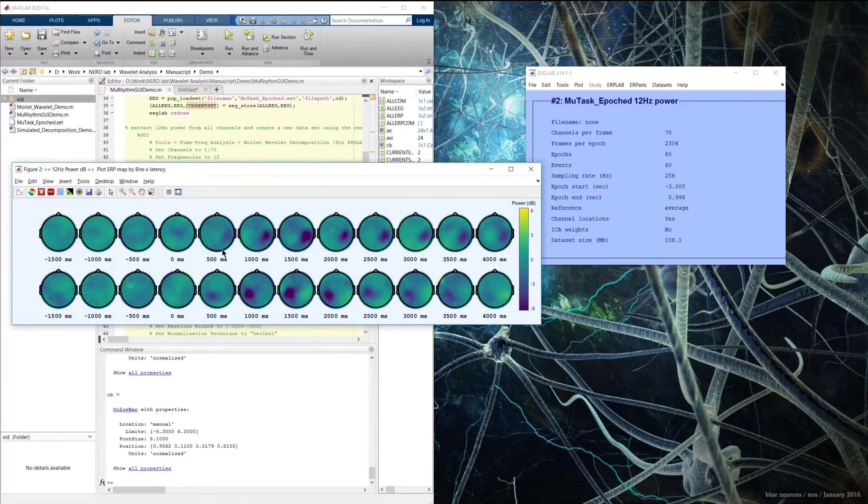You could use some of ERPLAB's plotting functions to view this data as line traces, but that's not usually how we'd prefer to view data across many frequencies. So I've added a plotting function to the TFA package specifically meant to plot frequency-by-time data averaged in ERPLAB, plotting each ERP set bin separately. This function is meant for a quick visualization without needing to exit the GUI and won't automatically format in the most optimal way, but you could dress up the figure in the command line. Here we can easily see power changes over time for each frequency at channel C4 when imagining left or right hand motor movements — C4 only registers left-hand movements, where you can see the large ERD at 12 Hz again. The power drops at higher frequencies are just the 12 Hz harmonics. The demo script contains equivalent commands that will produce identical results, and of course in script you have more control over plot appearance.